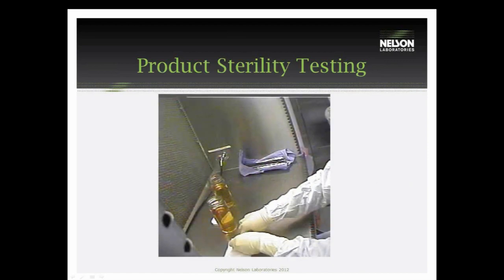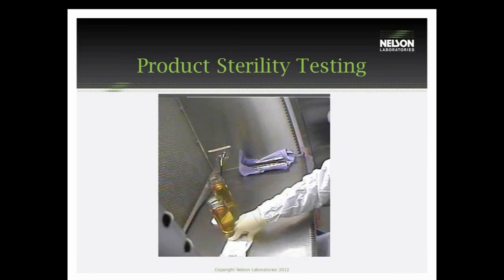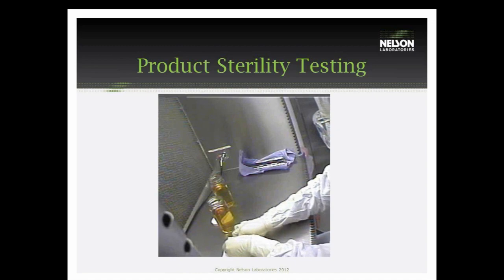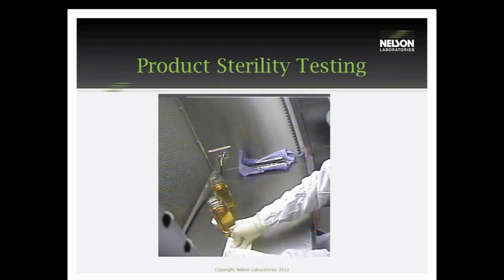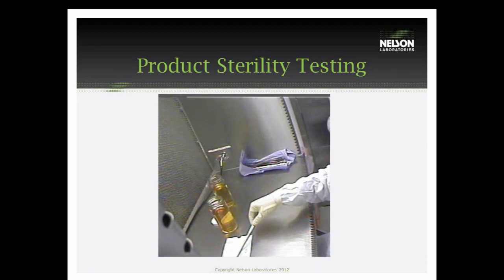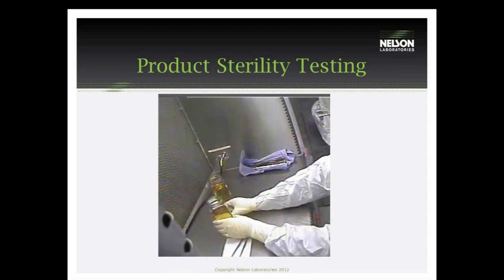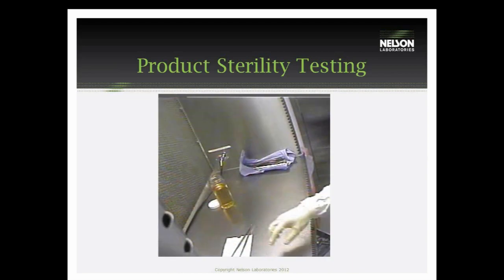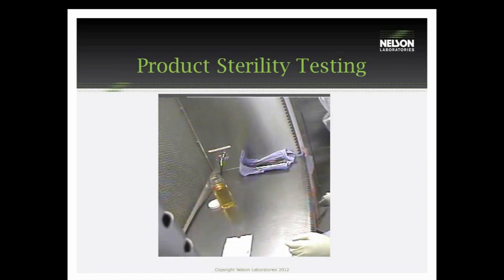This is a small video clip on product sterility testing and how it is performed. Essentially, in the clean room, we will unpackage the device. It will be dropped into one of two medias — a soybean-casein digest media and a thioglycolate media — to accommodate both aerobic and anaerobic growth. The jar of media containing the device will be placed in an incubator and incubated for a minimum of 14 days. The BI sterility testing is performed similarly, and this shows how it is performed — being dropped into the media.